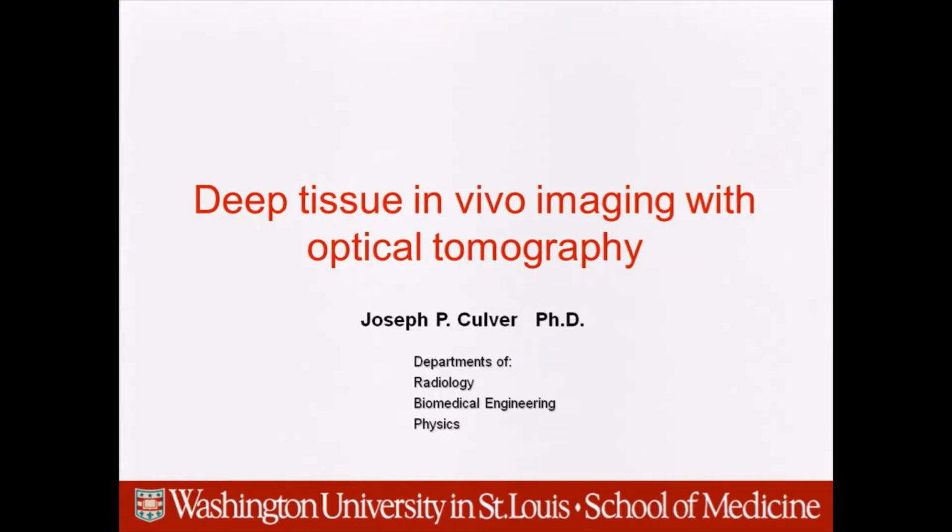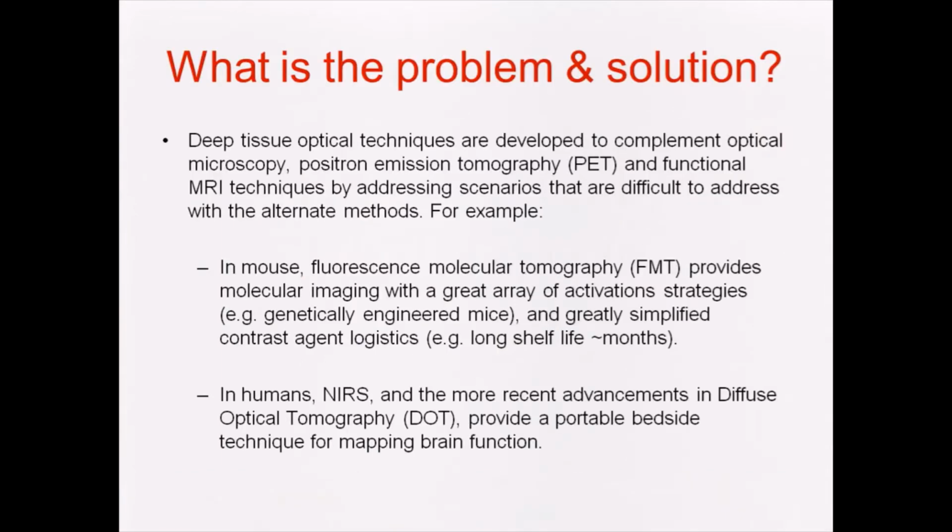What I'll be talking about is basically working in very highly scattered light imaging situations. The motivation for this is that deep tissue optical techniques were developed to complement microscopy methods, positron emission tomography, and MR techniques, and to address situations where those methods are not available.